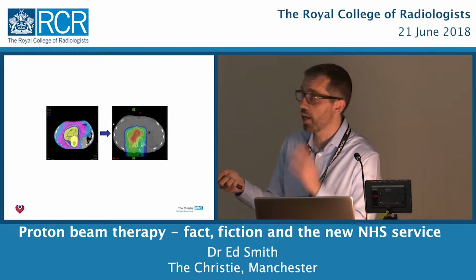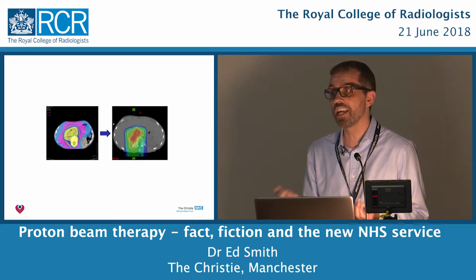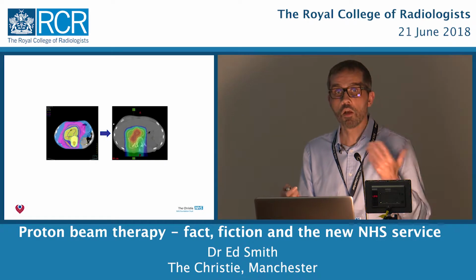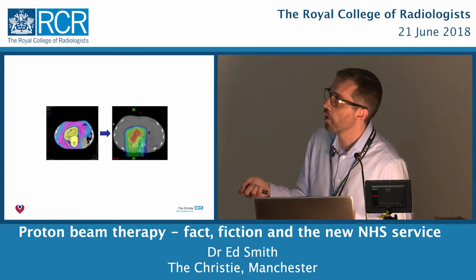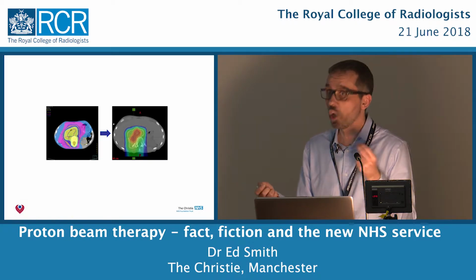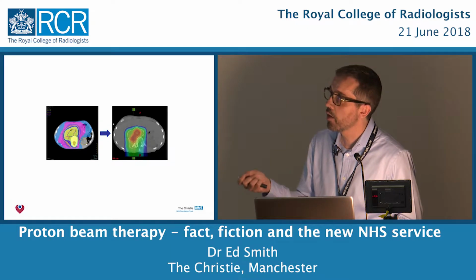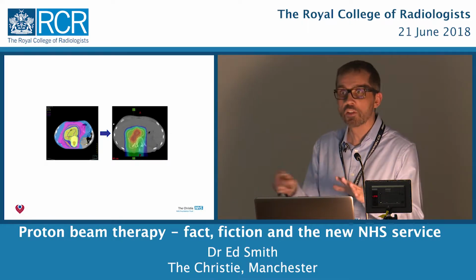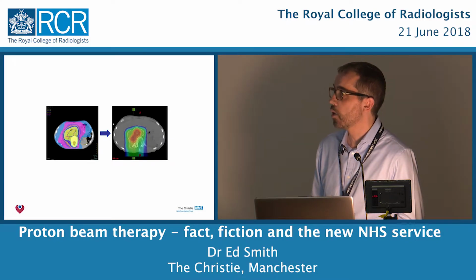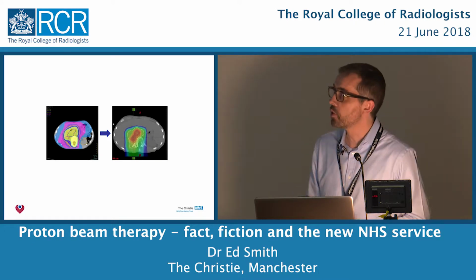Now, many would argue, and I completely agree with them, that much of this is of a very, very low dose and probably inconsequential to the patient. Though there is a second malignancy risk associated with low dose radiation. And so that's a particular concern in young people, whether they be children or teenagers, because they have a long time to live and a long time for second cancers to develop. And actually, when this technology was being introduced, I was a little bit reticent about its introduction, certainly for my younger patients. But quite often, it is the best way to get that high dose around the tumour.